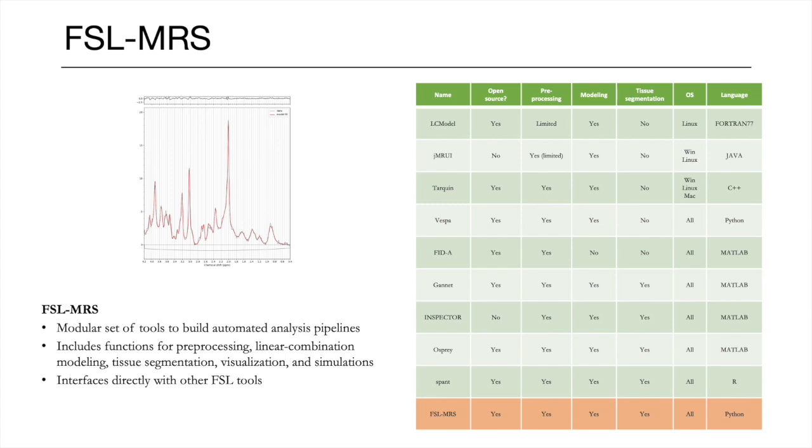And lastly, FSL-MRS is another set of modular tools to build automated pipelines, again including everything including processing, modeling, quantification, and simulations. It interfaces directly with established FSL tools for visualization.